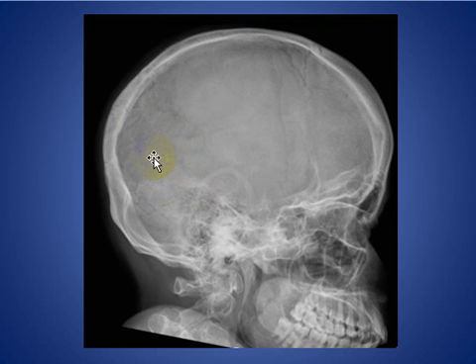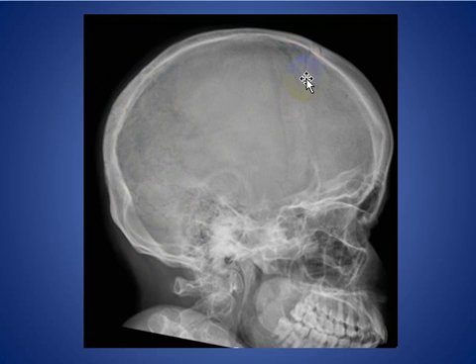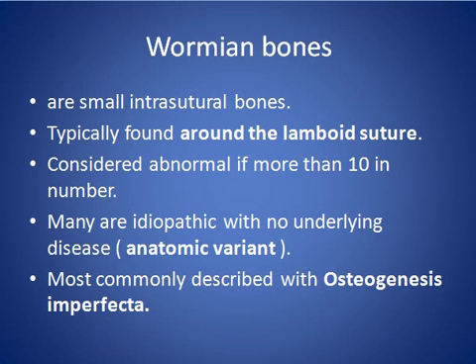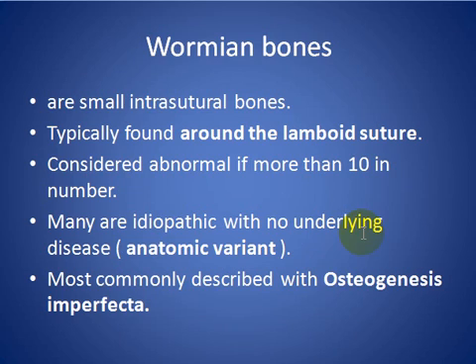You see multiple wormian bones, especially around the lambdoid suture, and these are also extended around the coronal suture. Wormian bones are small intrasuture bones typically seen around the lambdoid suture, considered abnormal if more than 10 in number. They are usually idiopathic with no underlying cause, a normal anatomical variant, and commonly seen in osteogenesis imperfecta.